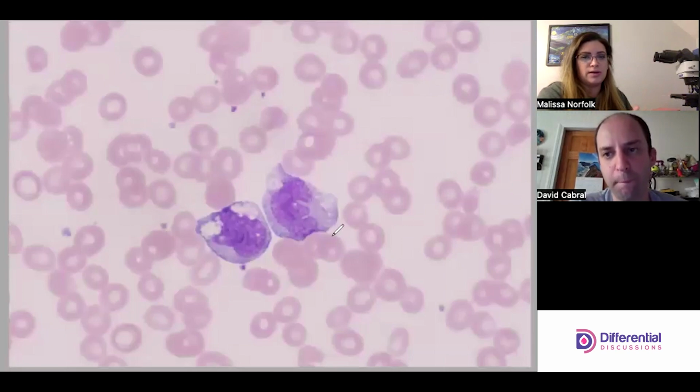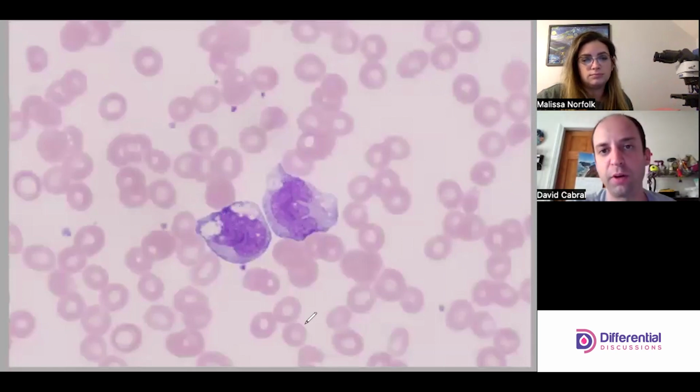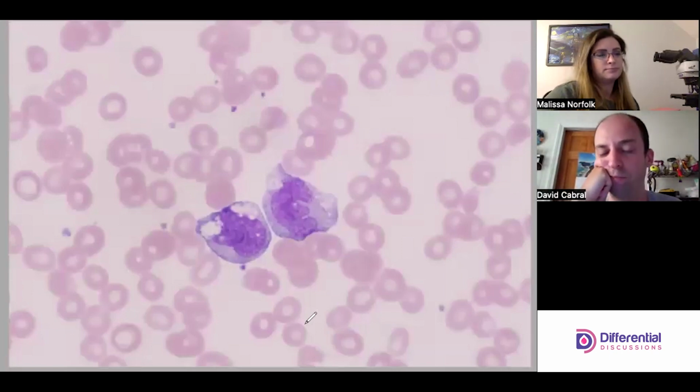Remember, we talked about it in a different video, kind of thinking about it looking like static, but purple and white static, especially in some blasts. And I'm seeing that it looks very immature here, much lighter, much more evenly stained as compared to this one. Yep, absolutely. So this will be a reflex to someone as their competency develops. You see that darkness right away. It's like subconscious. Yeah, I agree with you.